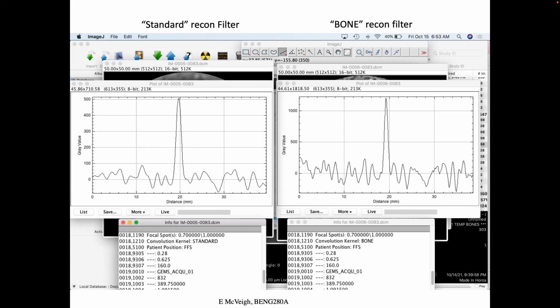So you could say it's more accurately determining the amplitude and the actual mu value of what's in that voxel than this one. This one is obviously wider than this. However, you look at the noise in the background here, and it's pretty darn high. So the signal to noise here is probably higher than it is here. So if detection is your goal, then you probably want to work in the signal to noise space, right here.